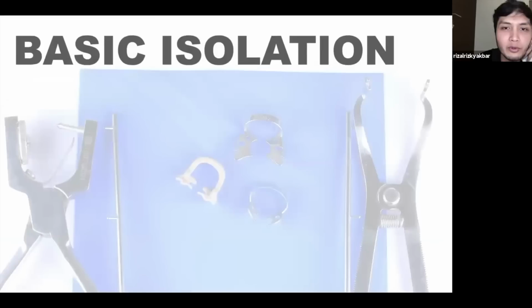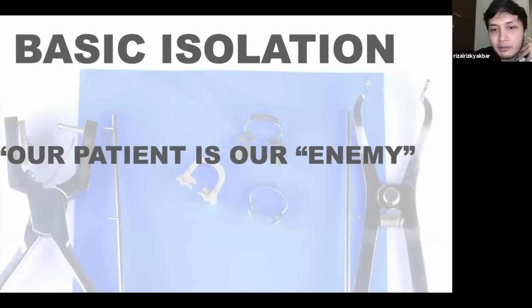Now we talk about the rubber dam. This is the basic isolation. Basic isolation is really important, because our patient is actually our enemy, right? I will introduce you to our biggest enemy. Tongue and saliva are really a nightmare.